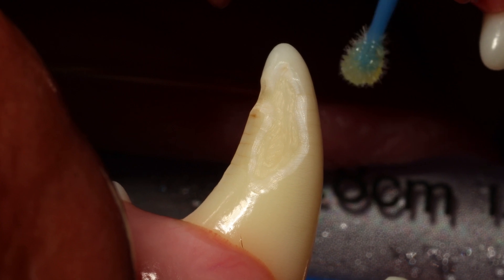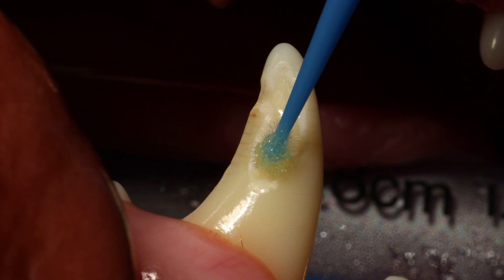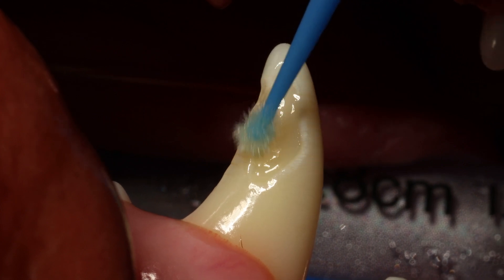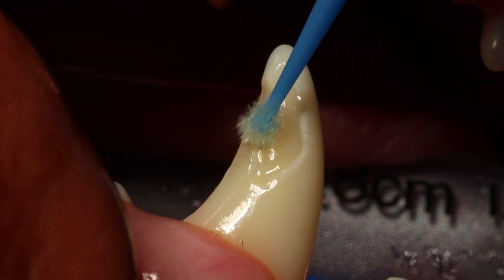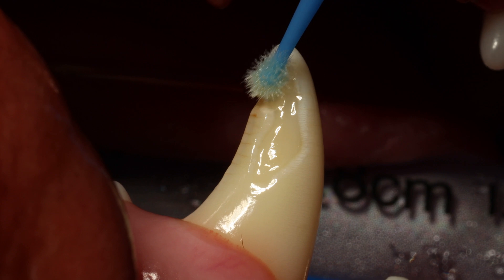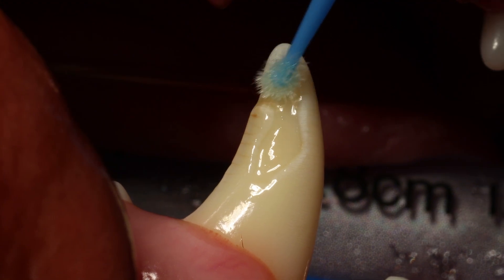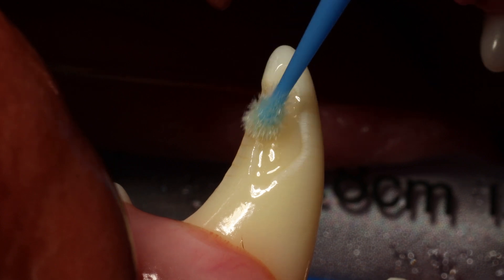After we air dry, we can easily see that nice surface here. The next thing is that you can either go with a 37% phosphoric acid right away, or you can use a self-etching bonding material. This is a 7th generation product called Futura Bond M+. When you apply it, it etches the surface and applies the bonding material simultaneously.